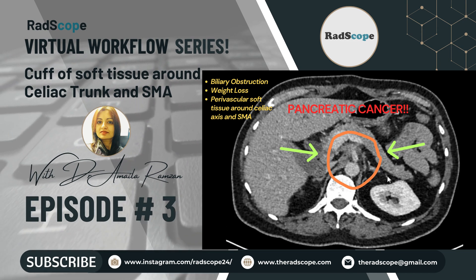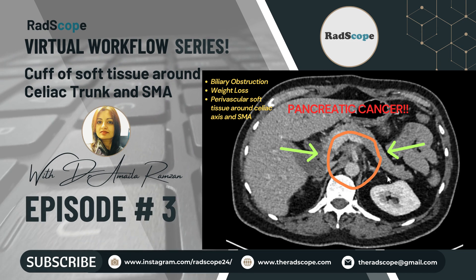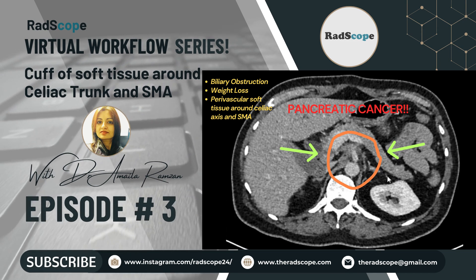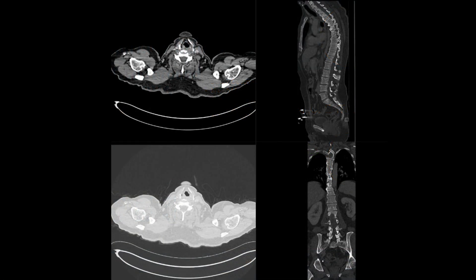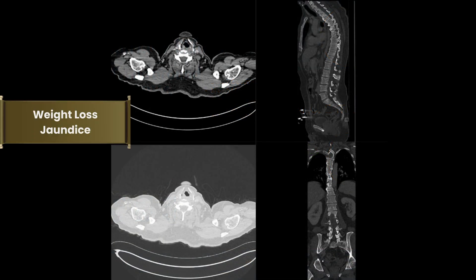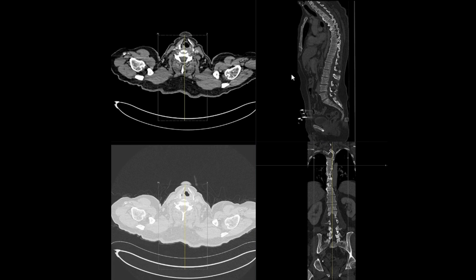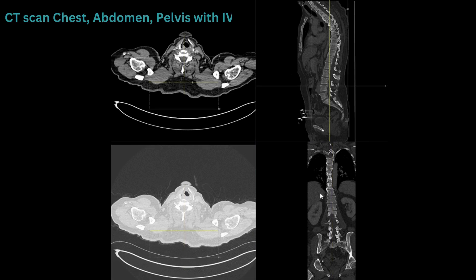Hello everyone, welcome to the next episode of the Virtual Workflow Series. Today's episode is about a patient who presented with weight loss and jaundice. In this patient we performed a CT scan of the chest, abdomen, and pelvis with intravenous contrast due to suspicion of malignancy, as this patient had considerable weight loss and raised bilirubin.